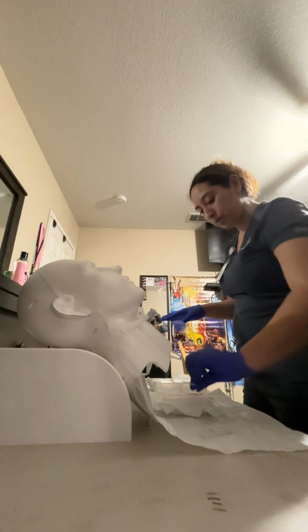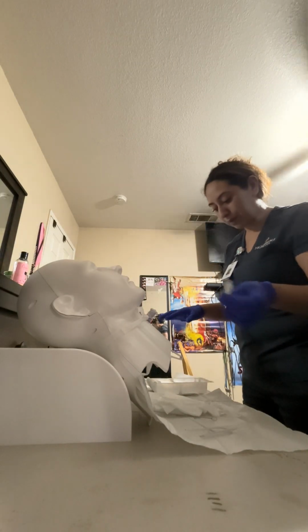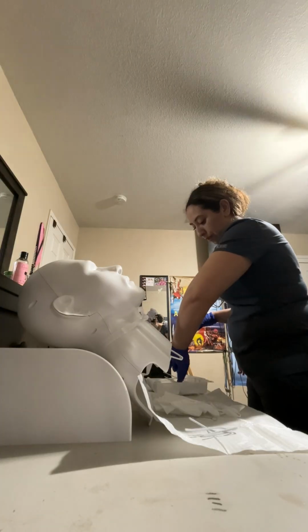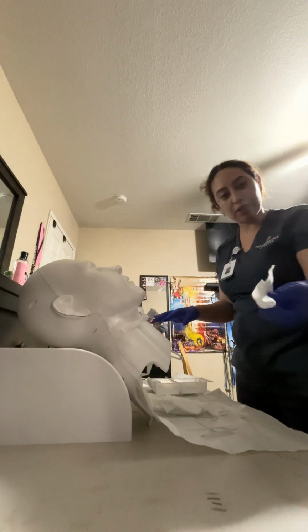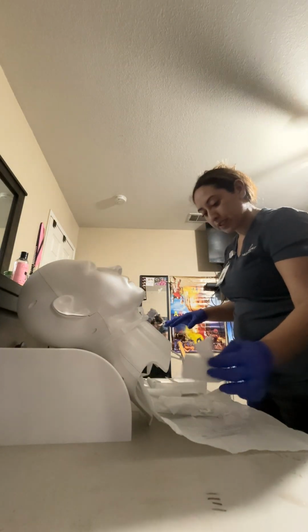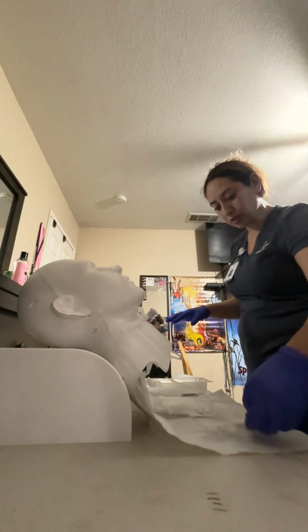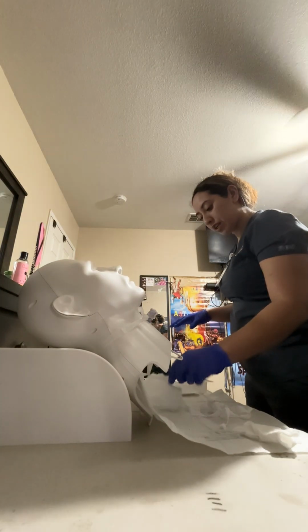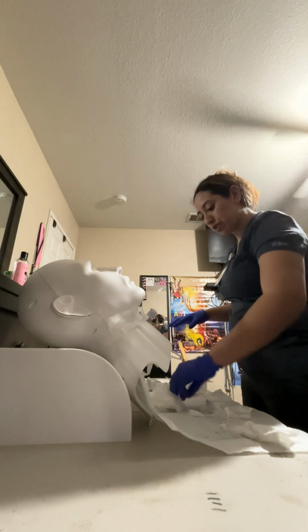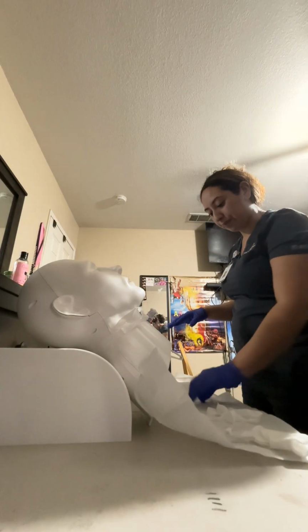I have some Q-tips here that I'll use to clean the stoma at a later time. I'm gonna place that in a clean soaking bin for later use. I have inside here some 4x4 dry dressings. Dry gauze pads. I'm gonna separate those. It has included a clean split gauze and new trach ties along with a bristle brush that I will use to clean the inner cannula.